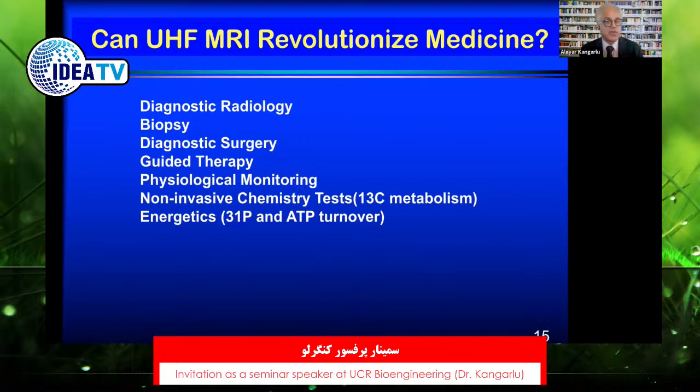The fact that MRI with various modalities, including spectroscopy, can really replace biopsy and invasive procedures, and perhaps even someday diagnostic surgery, and has been used and will probably be even more used in guided therapy in the future. Because we are now really incorporating motion in MRI, it can also be used for physiological monitoring, a next level of physiological monitoring, not the same as the physiological monitoring systems that we have, which are really at the mercy of the chemistry of those instruments.